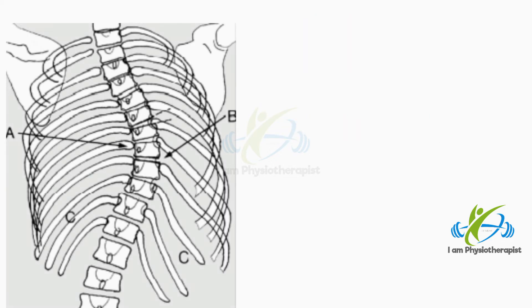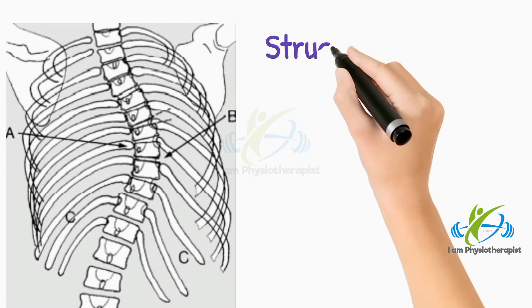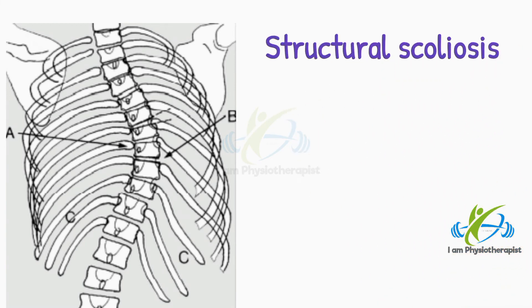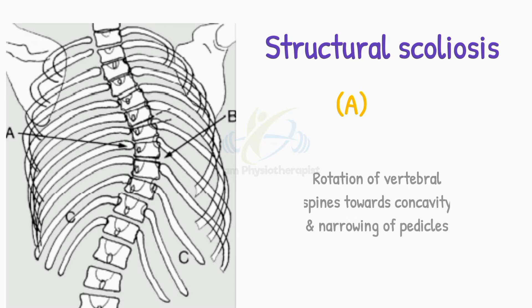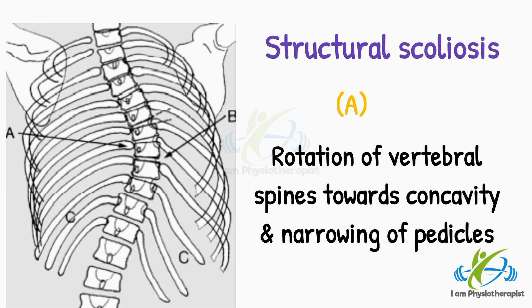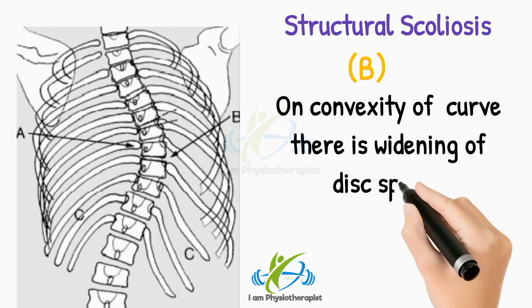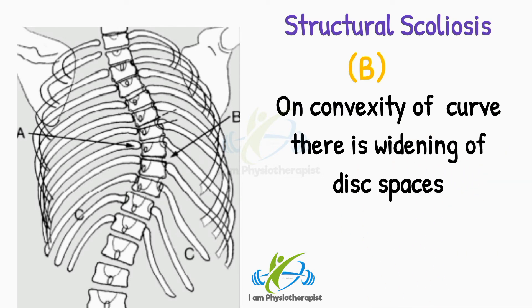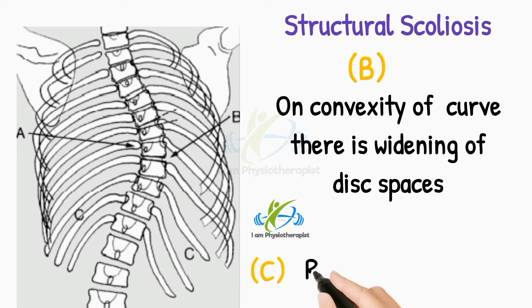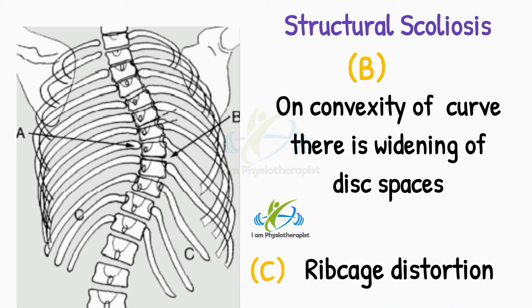Note the presence of any structural scoliosis. This is associated with rotation of the vertebral spines towards the concavity, indicated by point A, and narrowing of pedicles. On the convexity of the curve, there is widening of disc spaces, indicated by point B. In the thorax there is ribcage distortion, indicated by point C.